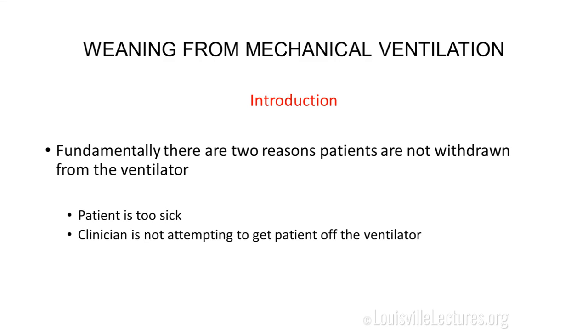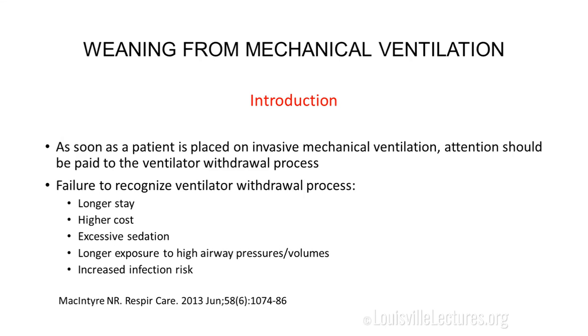So, fundamentally, there are two reasons why your patient is not going to be withdrawn from the ventilator. And that is that the patient is too sick, or the clinician is not attempting to get the patient off the ventilator. Oftentimes, the clinician is not attempting to get the patient off the ventilator. So as soon as the patient is placed on invasive mechanical ventilation, you should start paying attention to the withdrawal process. When am I going to get this patient off the ventilator?